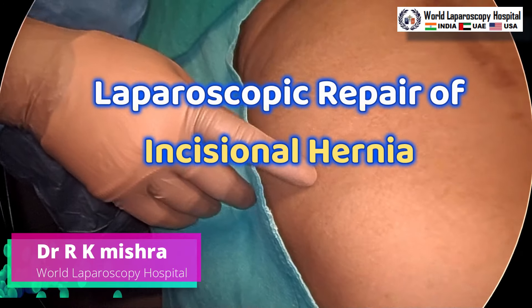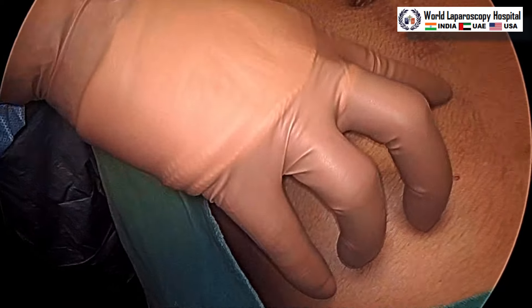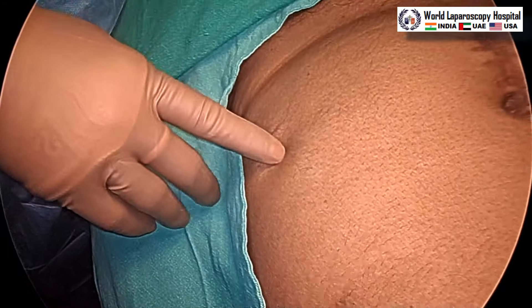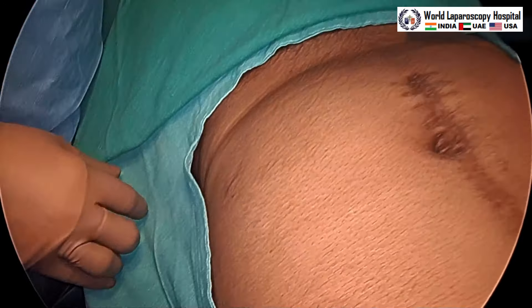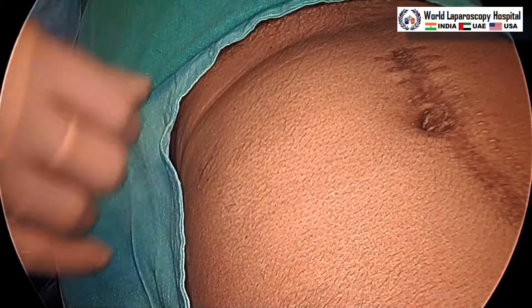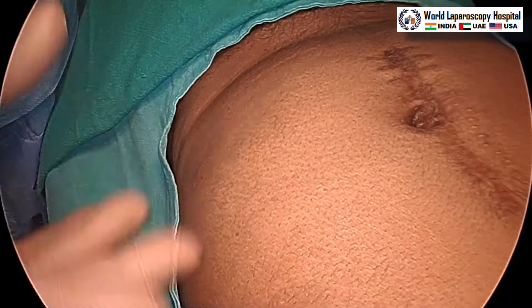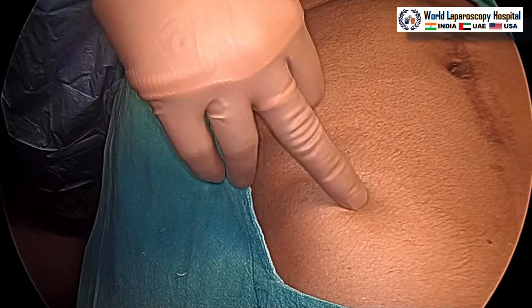Hello friends. Palmer's point is used for this patient to perform diagnostic laparoscopy a few years ago. After that, the patient developed obstruction and laparotomy was performed with a midline incision, then some infection happened, and later an incisional hernia developed. This is a Swiss cheese incisional hernia.